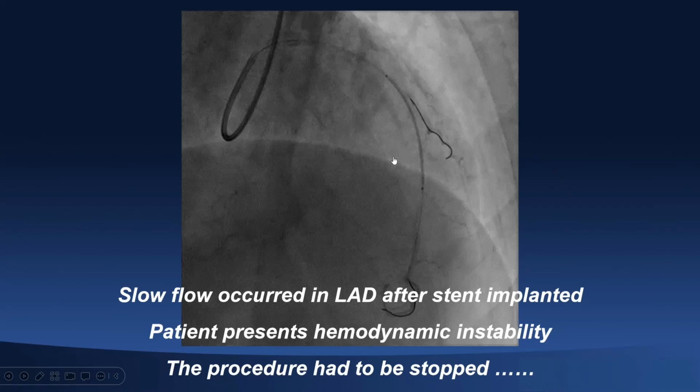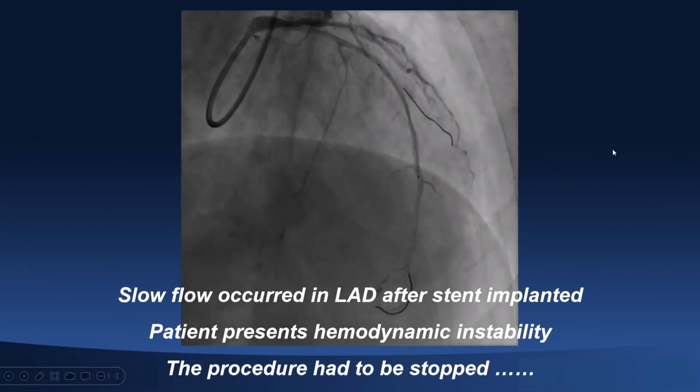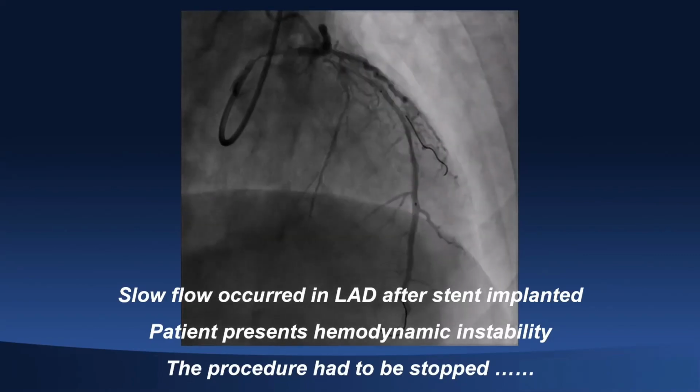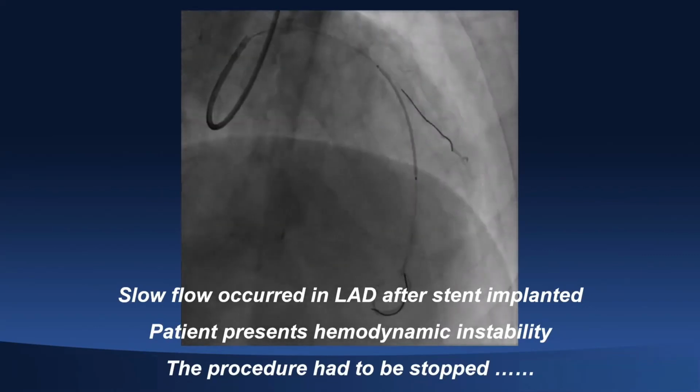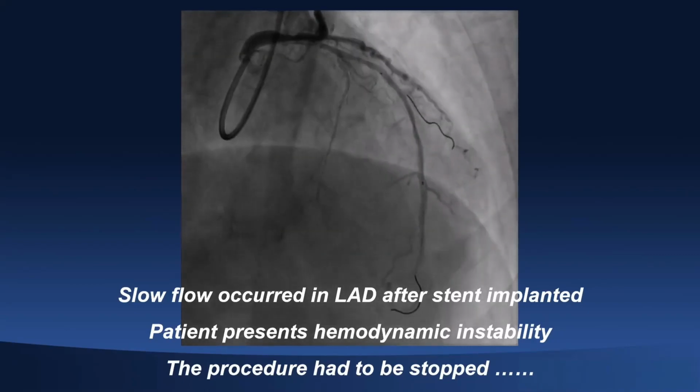Patient is now bound for complex IVUS and/or OCT-guided PCI of left main to LAD using RA and/or shockwave IVL, and we will analyze the characteristics of the proximal lesion and evaluate the LAD stent expansion by the intravascular imaging.